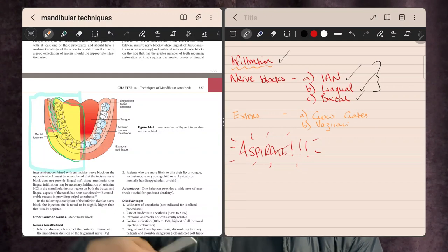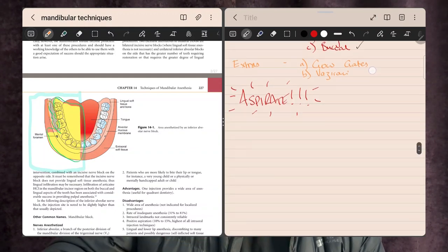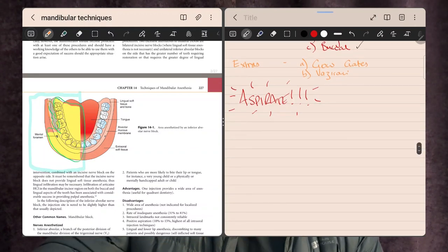Just before we get started, always remember to aspirate, aspirate, aspirate. That's something I've highlighted here — and let's get into the infiltration of the lowers.